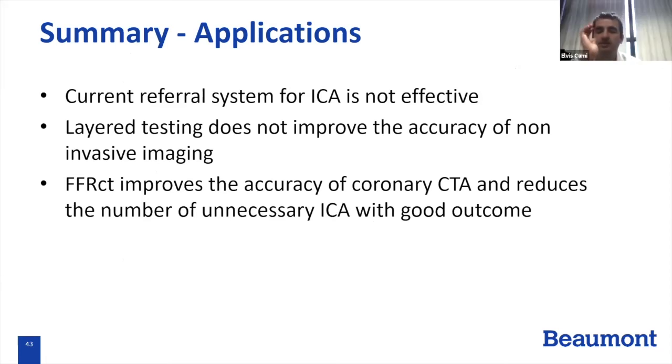Yeah, of course. So one is, one of the biggest problems with coronary CT that's been criticized over the last 15 years is that calcium lowers our ability to tell what's going on in the patient. So a couple of questions about calcium. Do calcified vessels also reduce the accuracy of the FFRct? Yeah, and the short answer is yes, it does.